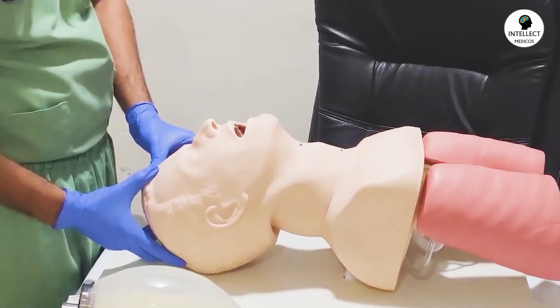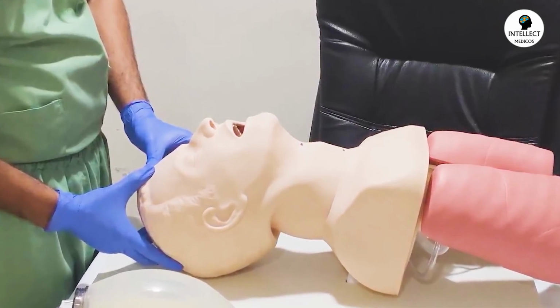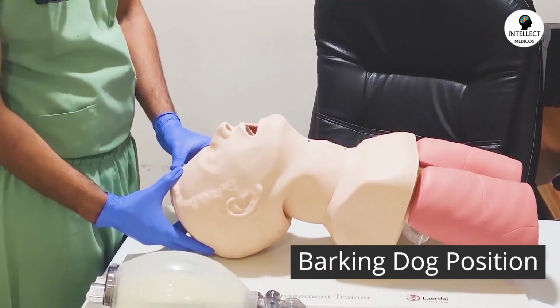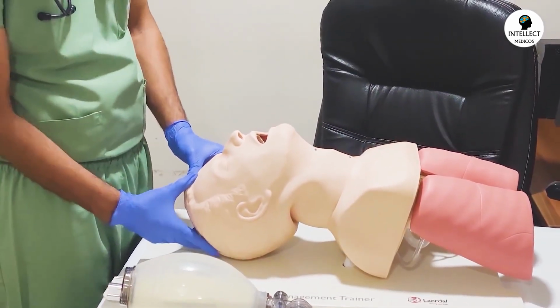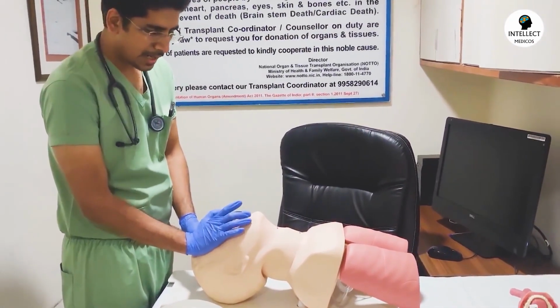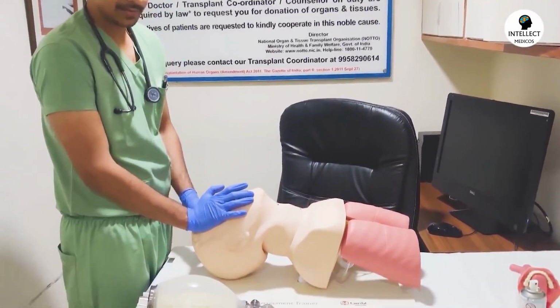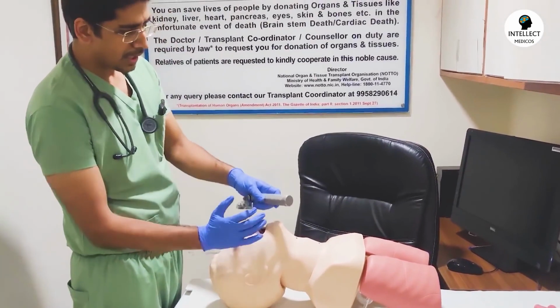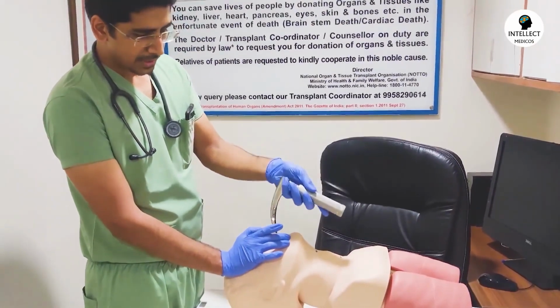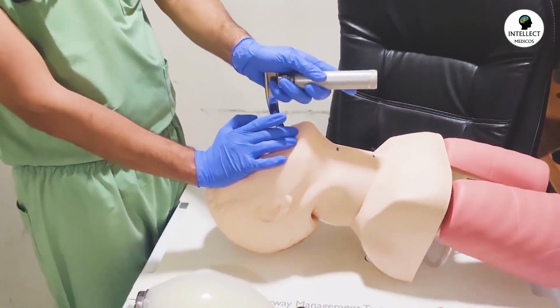So this position, having flexion at the neck and extension at atlanto-occipital, is called the sniffing position or barking dog position. And then you have to hold the head over here with the heel of one hand over the forehead of the patient, and you yourself have to open the mouth of the patient like this with the fingers, right? And now holding the laryngoscope in your left hand, you go inside and deviate the tongue from right to left.